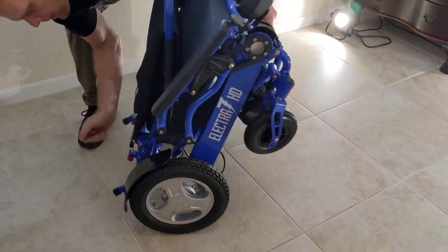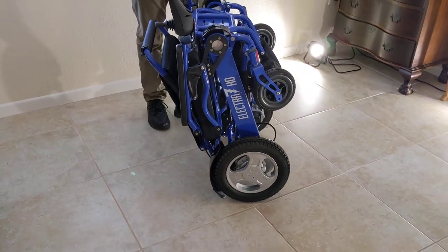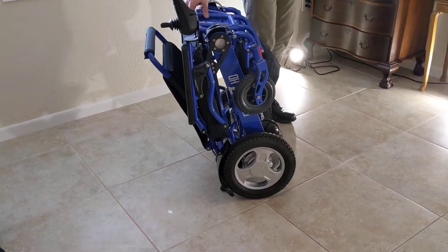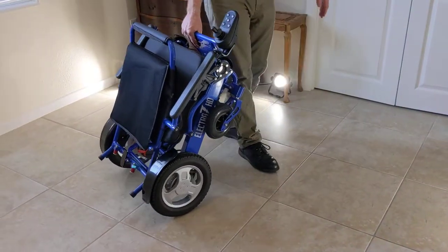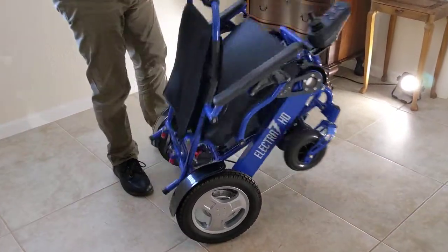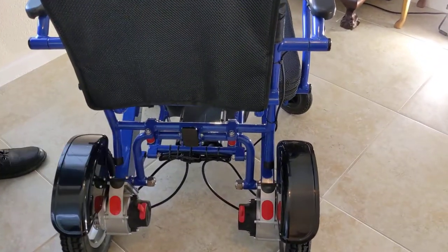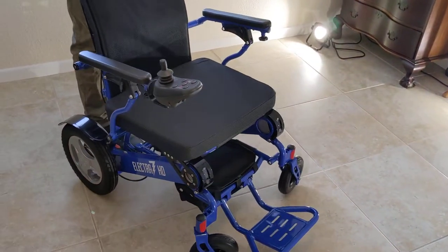The chair folds up very easily with a little bit of a kickstand. In three-wheel mode, I unlock the wheels and allow the chair to fold up, taking a very small amount of space. To transport it, just grab the footrest and move the chair around. To open the chair, just unlatch it with the latch in the back and gravity does the work.